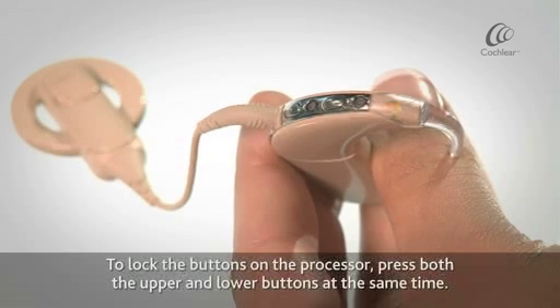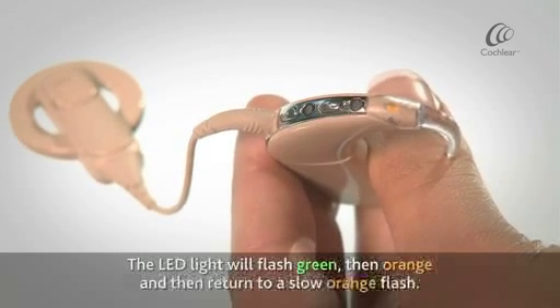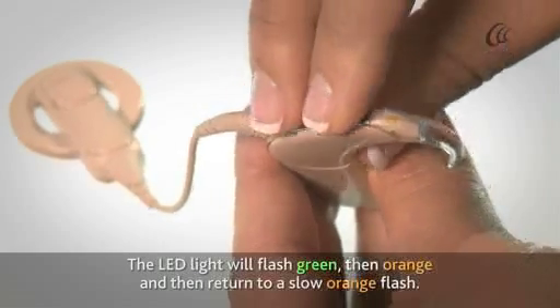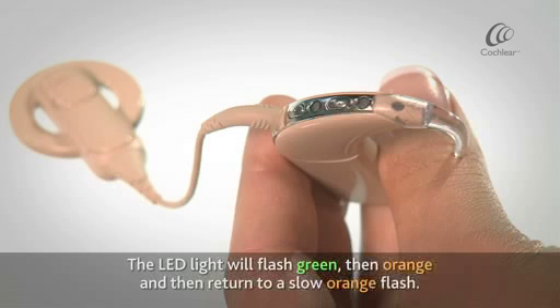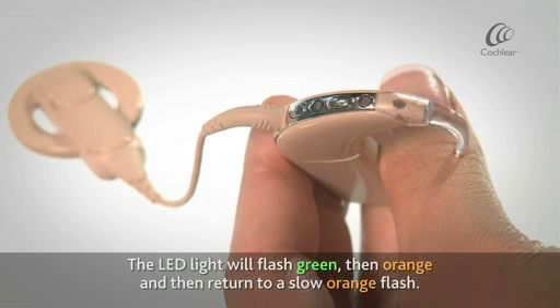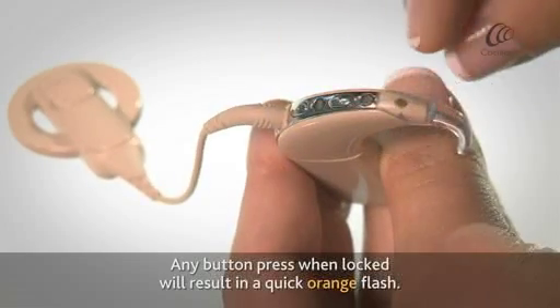To lock the buttons on the processor, press both the upper and lower buttons at the same time. The LED light will flash green, then orange, and then return to a slow orange flash. Any button press when locked will result in a quick orange flash.